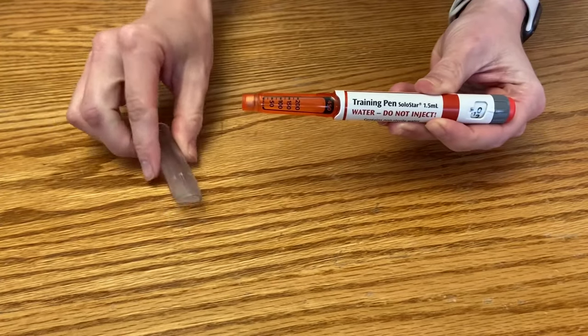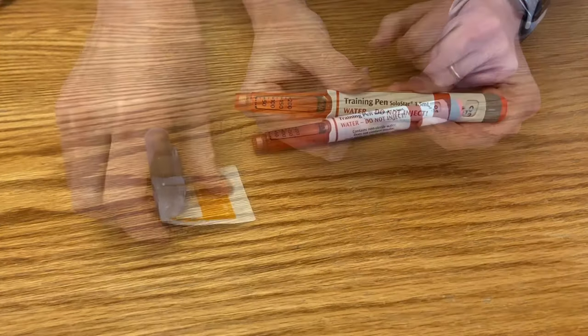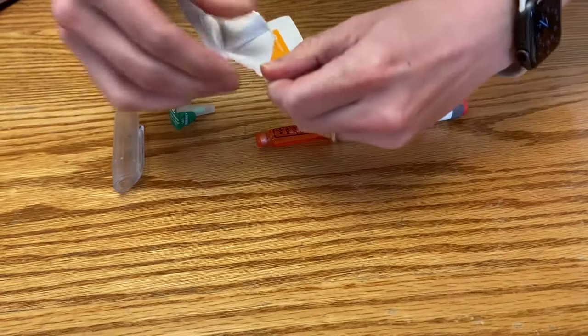First, remove the cap of your insulin pen. Then take your alcohol wipe and swab the rubber stopper at the tip of the pen.